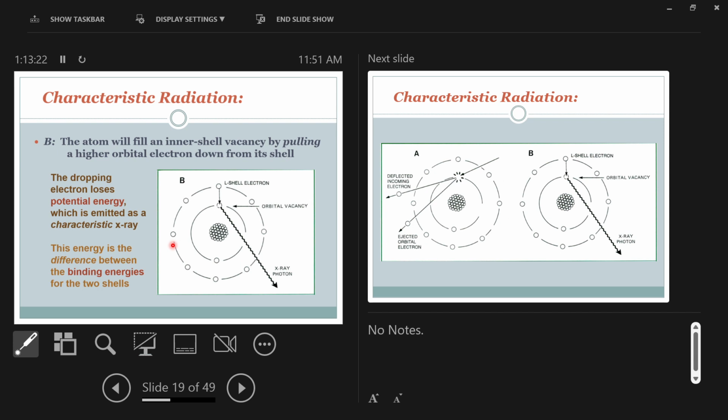Again, K doesn't mean anything. It's kind of like on an EKG where we say, here's the P, Q, R, S, and T wave. They don't mean anything, right? P means that's the P wave, but P doesn't stand for anything. K does not stand for anything here. It's just that the beginning of the alphabet got used by other things, okay? So we don't say A, B, C, D. We can instead say shell 1 and shell 2. That's okay too, but we like to say K shell.